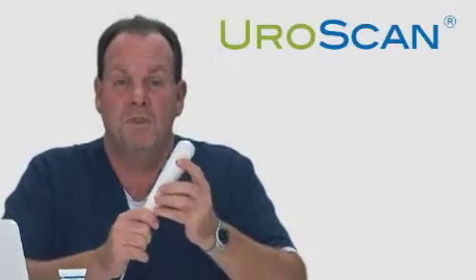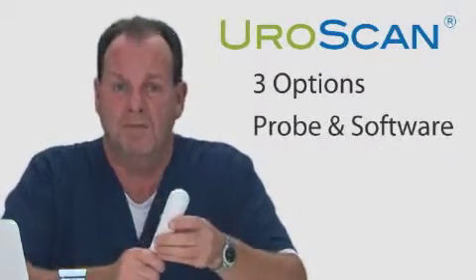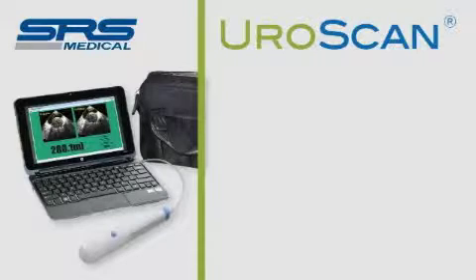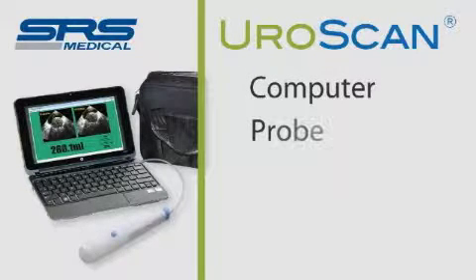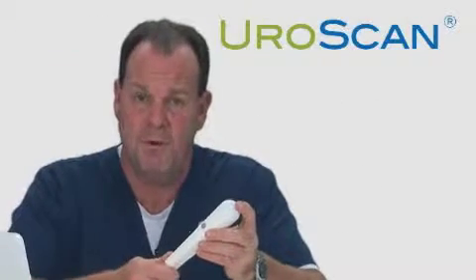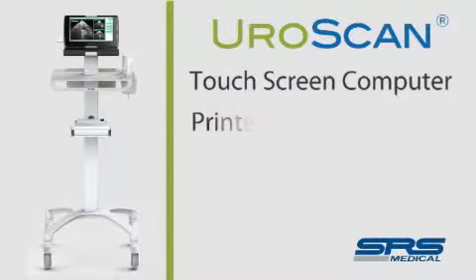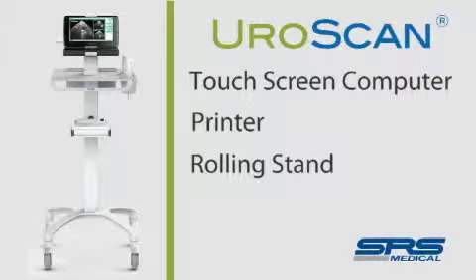The UroScan comes with three configuration options. Number one is the probe and the software itself. Configuration two is with a laptop computer, the probe, a carry case, and a mobile printer. Option three is a cart-based option, which comes with a full computer, a printer, and a rolling stand.